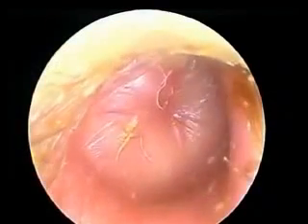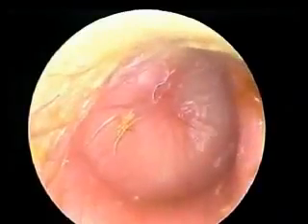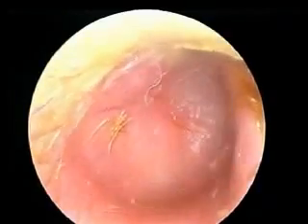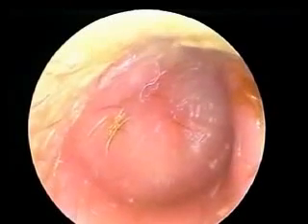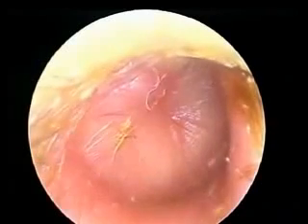Proper performance of pneumatic otoscopy is critical for the accurate diagnosis of acute otitis media and otitis media with effusion. Clinicians should master this technique in order to provide optimal care for children with this common condition.